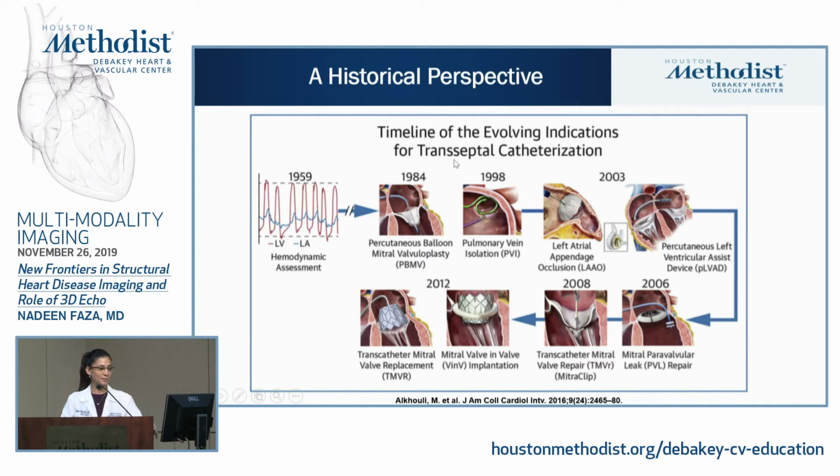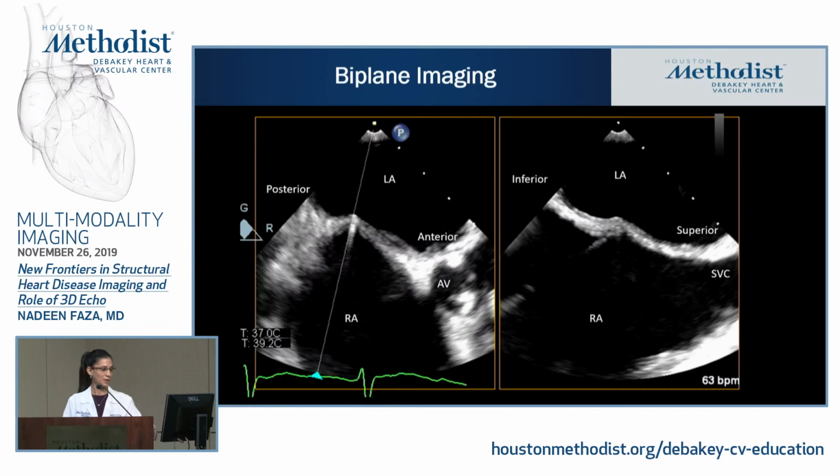So the transseptal puncture step is a very critical step because each procedure requires a certain precise location for the transseptal puncture based on the trajectory of the catheters that you would need to ensure procedural success. And spending time during the procedure to get your ideal transseptal puncture is key.